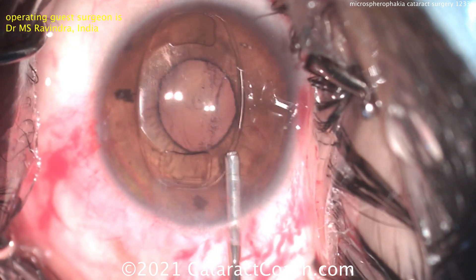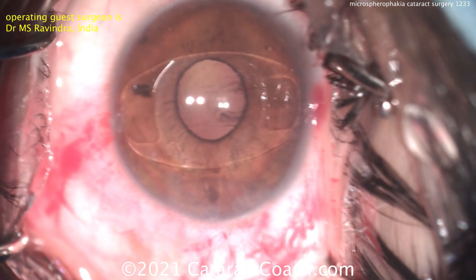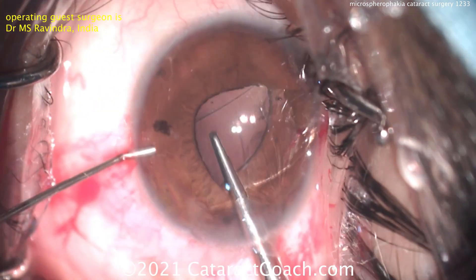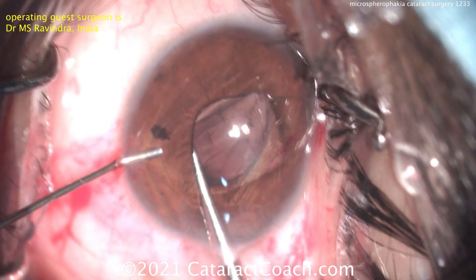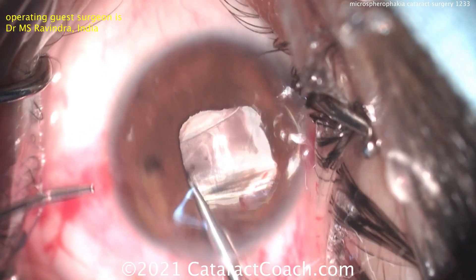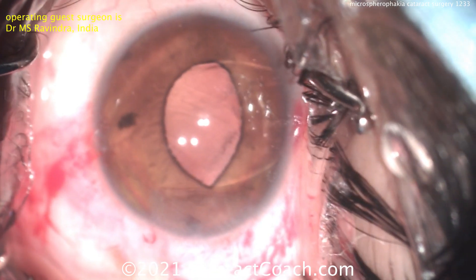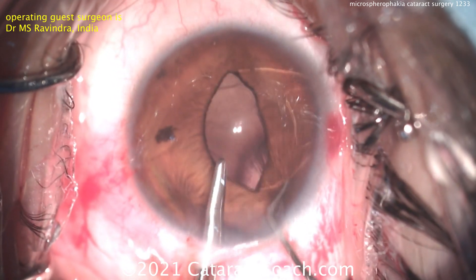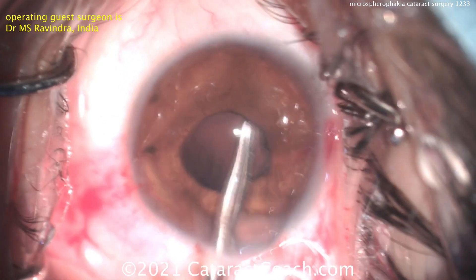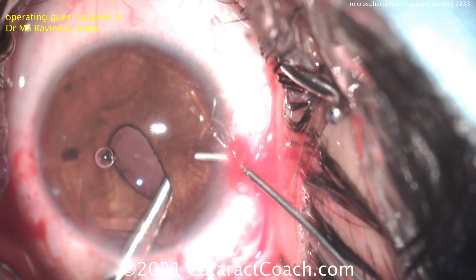Maybe this patient would benefit from other forms of IOL fixation. In this case, putting in an iris clip lens — that's a good choice here, because there's really not enough support to have a regular lens. The iris clip lens can be placed on the anterior surface of the iris or the posterior surface. Unfortunately, in the USA these lenses for pseudophakia are not available. But outside the US, you can enclavate the iris and trap it in that pincher arm of this IOL. Putting the lens into position, being very careful — I like this two-handed technique — and then using the other hand to get a little bit of iris enclavated.